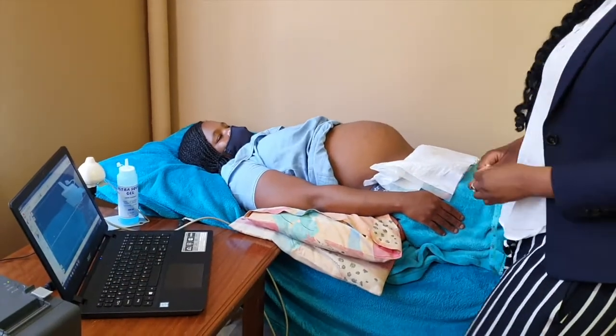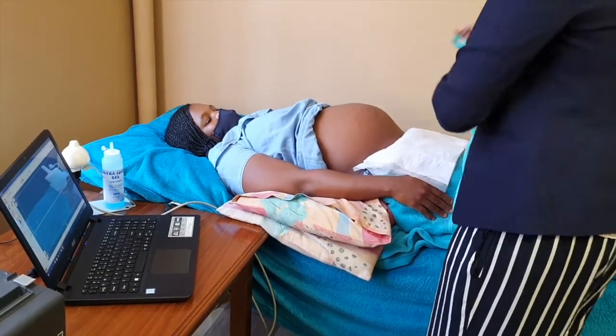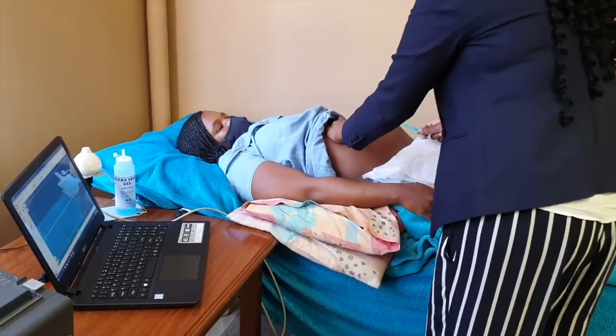The doctor will start by palpating the abdomen for the fetal lie and will measure the symphysis fundal height. Palpation of the abdomen is important to examine the fetal lie and the position of the fetal spine.